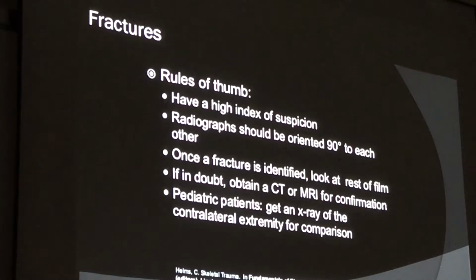If you're a beginner and you're looking at pediatric films, it's always best to look at the contralateral side, because pediatric patients with their growth plates can be confusing. It can be confusing for fractures.